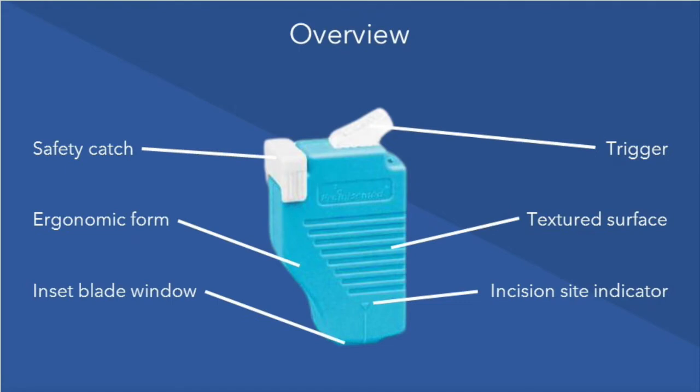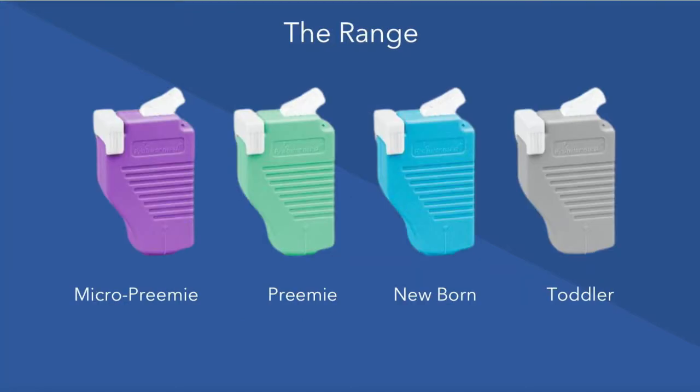The Microdot Sweeping Blade Heel Lancet is a simple and safe way to obtain a neonatal infant blood sample. The device is available in four sizes: micro preemie, preemie, newborn, and toddler.